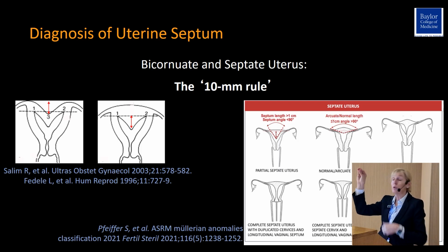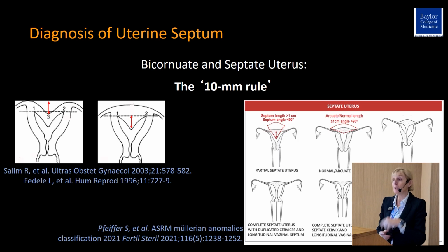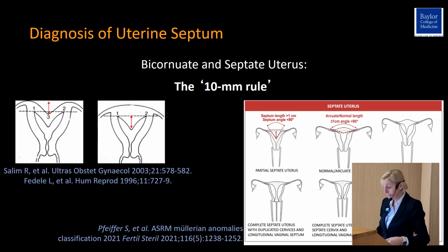The ESHRE classification instead considered 50% of the fundal thickness, which also was revised a couple of times. But none of these investigators really took into account the patient's symptomatology or anything else.